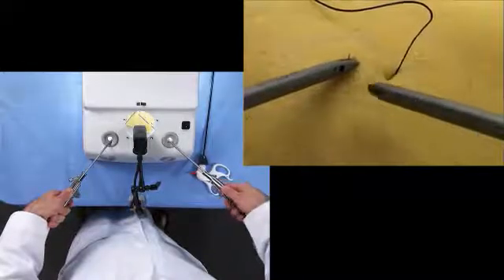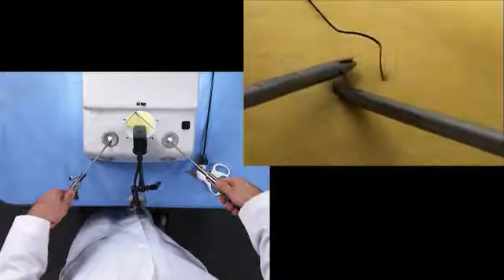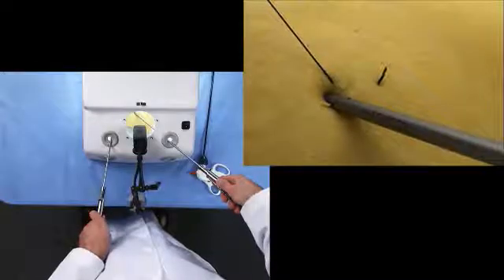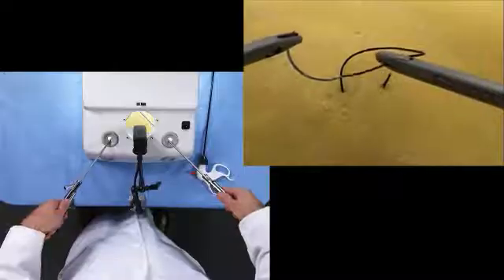We can release the right, use the right hand to stabilize the tissue, and rotate out following the curve of the needle, carrying the needle to the 11 o'clock position and leaving a short tag. We then bring the needle back over the knot.